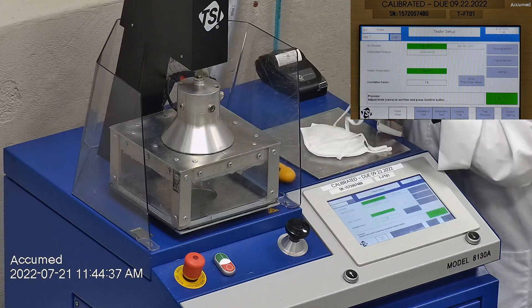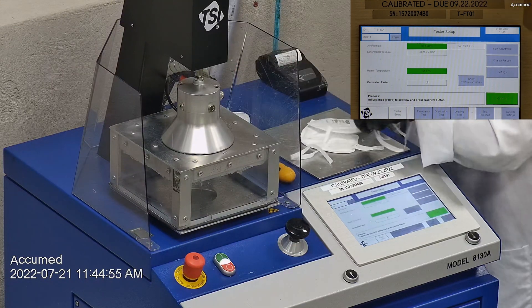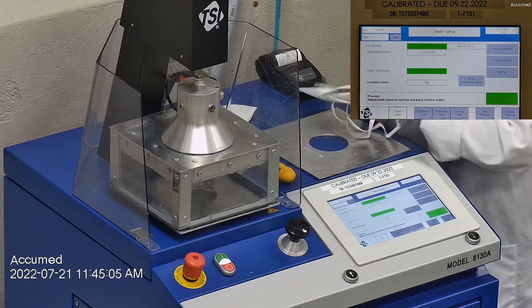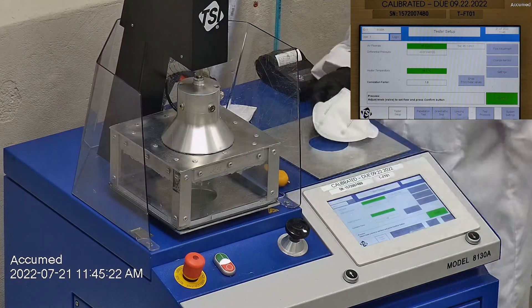We first run a tester setup and start by removing the headband from the respirator before placing it onto the testing plate to ensure a proper seal. Then we make sure that the mask is properly and completely sealed with hot glue to the testing plate. When applying the hot melt glue we make sure that there are no holes or leakage around the seal to ensure accurate results.